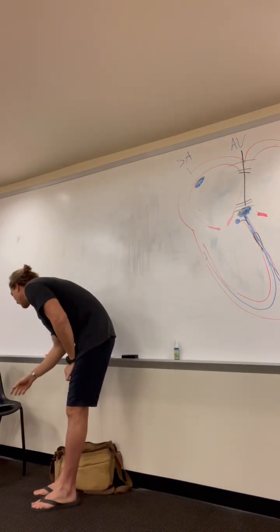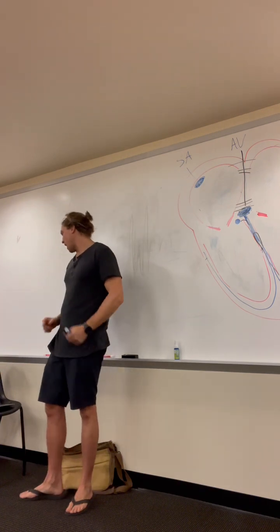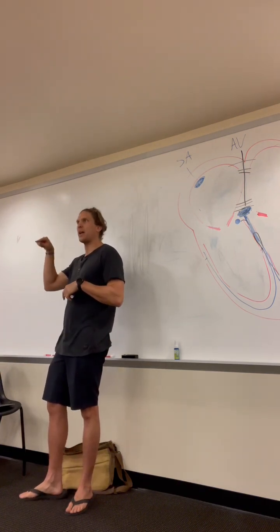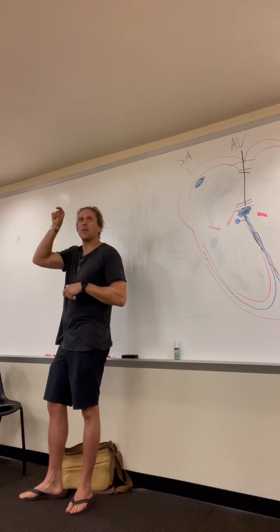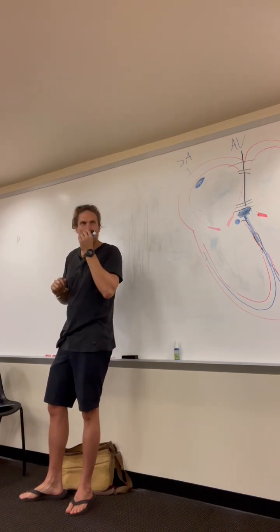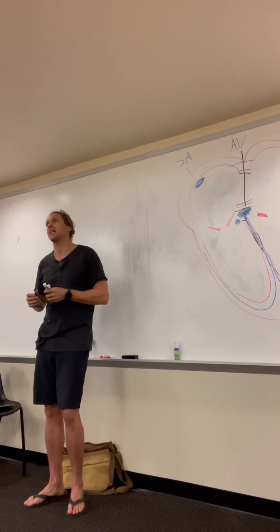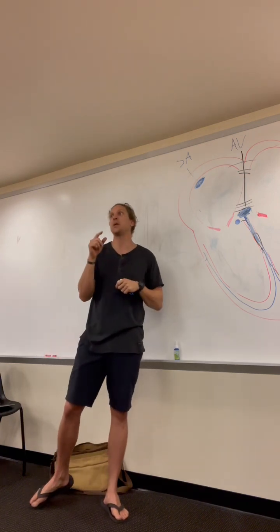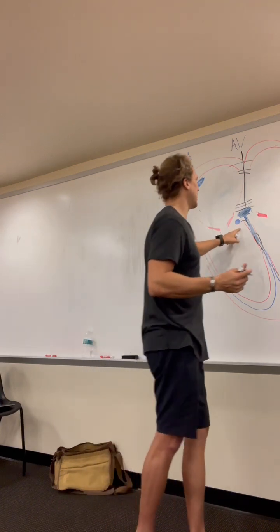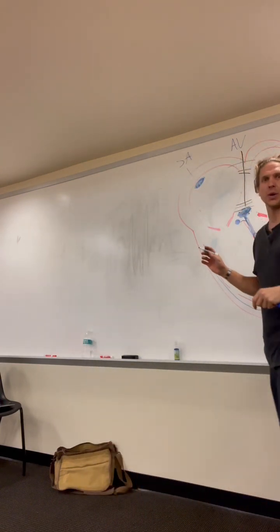Now, look at that second QRS complex. When it goes back up for what I would call the T wave, there's like a tip on the top of it. I think that's a P wave hidden in the QRS. And she mentions it in our slideshows. You can have an upside down P wave, you can have a P wave hidden. So I'll draw out what's happening to explain that.